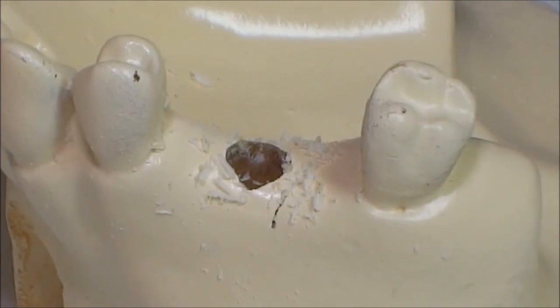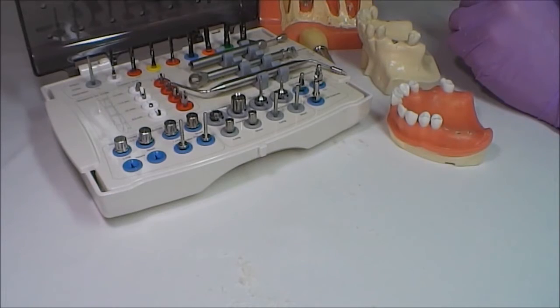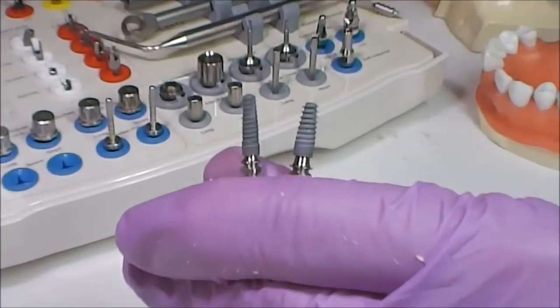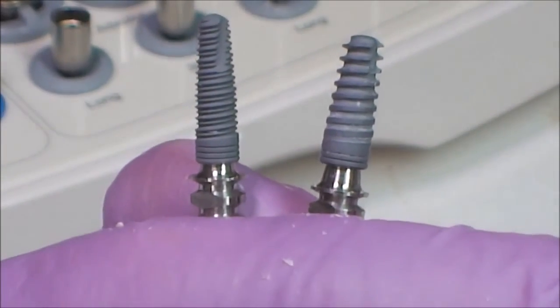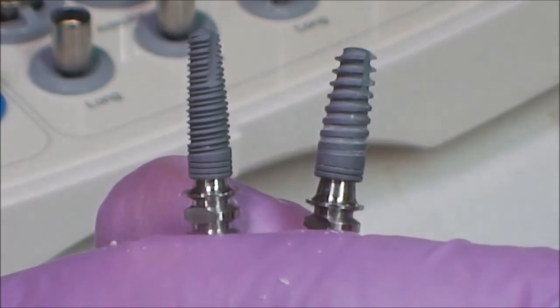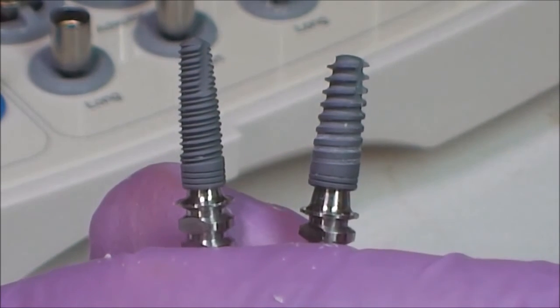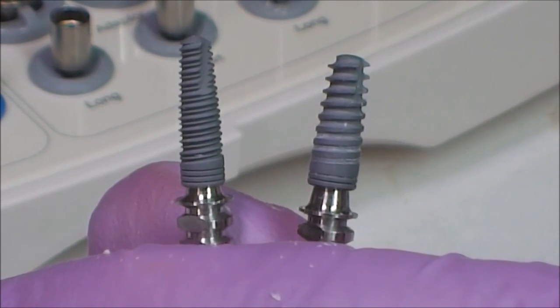The site is now prepared for the 5.5 millimeter diameter implant. We have demonstrated the classical surgical protocol for thick bone type implantation with D2 bone. However, each implantation is individual and the surgical protocol can be changed according to the thickness of the bone and type of implant surface. When using an implant with an aggressive surface, the drilling protocol can be modified according to its ability for self-drilling and compaction of the bone.